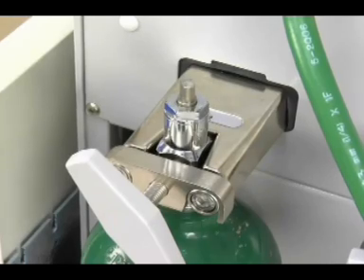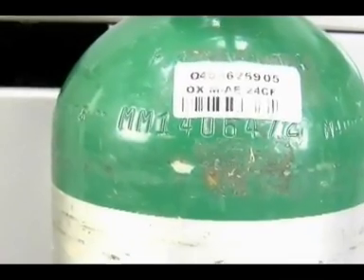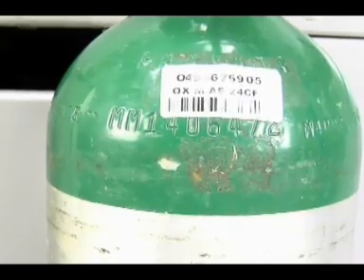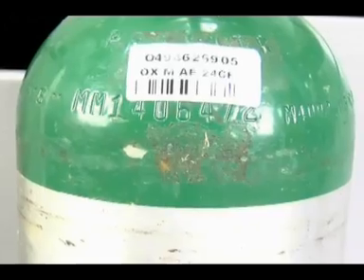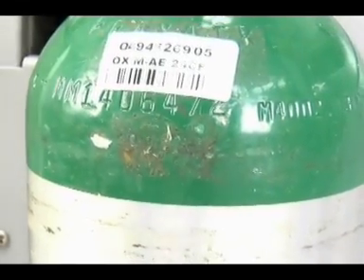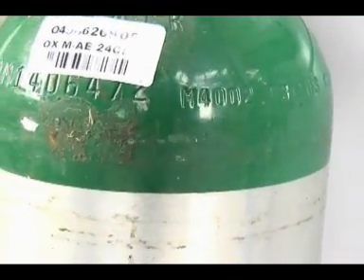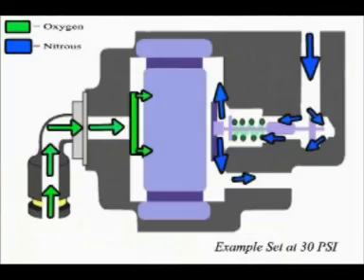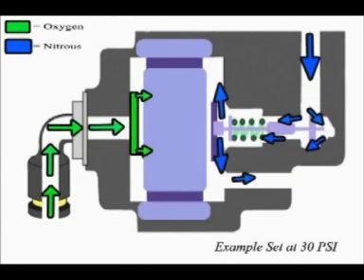The standards for cylinders are written by the U.S. Department of Transportation, the DOT, the Compressed Gas Association, the National Fire Protection Association, and the American Society of Mechanical Engineers. These cylinders are marked with DOT, service pressure, serial number, commercial design, inspection date, and inspector's mark. The cylinders are usually inspected every 10 years and can be identified by the capacity, color, and markings on the cylinder.